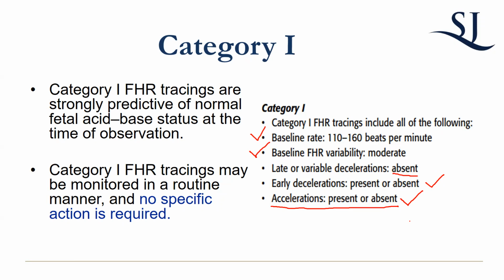Sometimes in non-stress testing, which is NSTs, you'll hear, oh, patient's here for NST, right? There you do need accels, okay? Because non-stress testing is in a patient who is not in labor. And then that's just assessing fetal well-being. For all intents and purposes, it's the fetal heart rate tracing, just as I've described to you. But the criteria are a little different. All right.